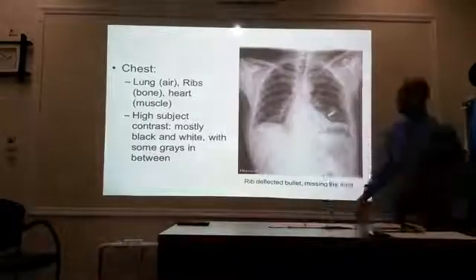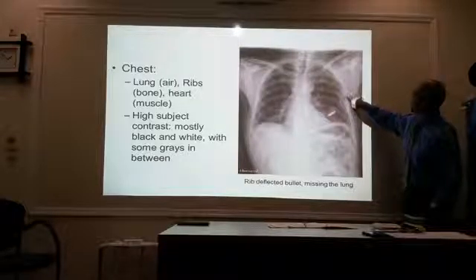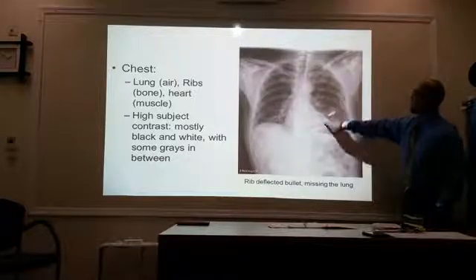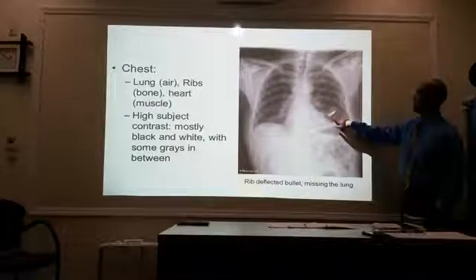Gunshot victim. Here's the entrance point. Broke some ribs. Boom, boom. Just missed the heart. So you got the shrapnel just sitting right there.